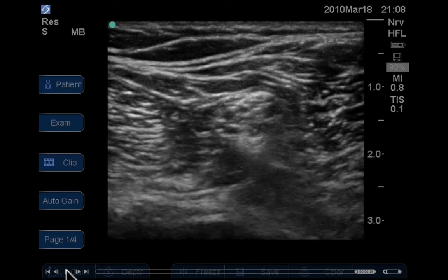Essentially you can block the nerves depending on the position you get the patient in. You can have this patient prone with their foot on a rolled up towel to slightly flex the knee. You can have the patient lateral with the side to be blocked uppermost.